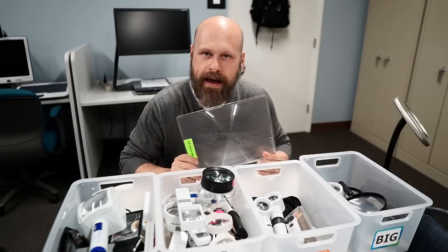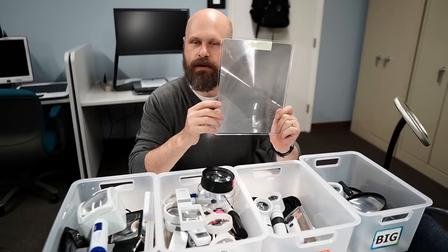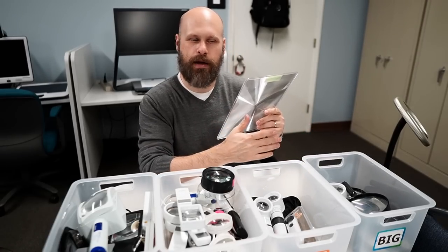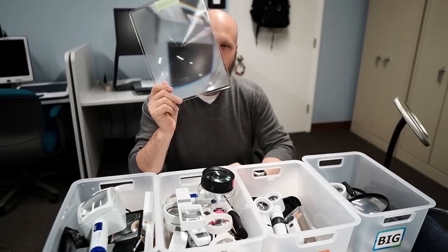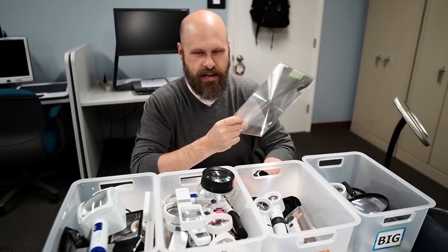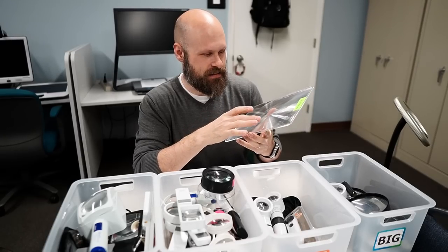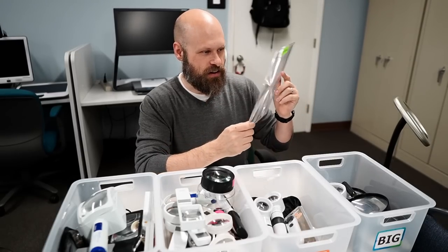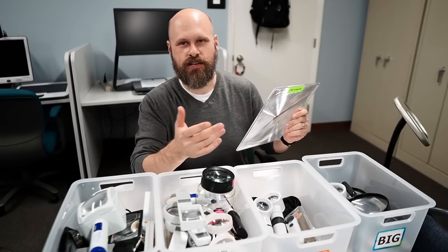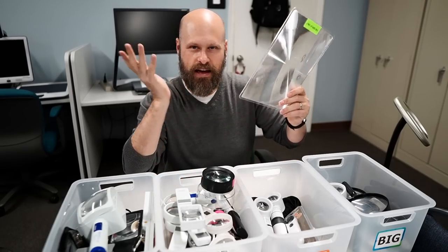Also part of the specialty magnifiers are page magnifiers — the size of a sheet of paper, used for magnifying full sheets or pages in a book. I will tell you guys: never get the page magnifiers. They're terrible. They don't work. They use a ridge system to do the magnification, and there's all kinds of glare and distortion and they don't magnify that much. I really recommend not using page magnifiers ever.